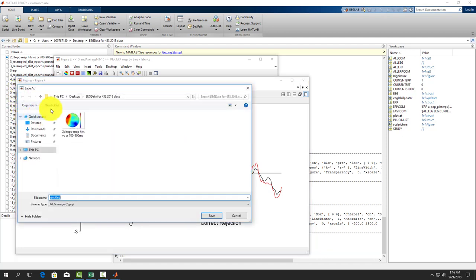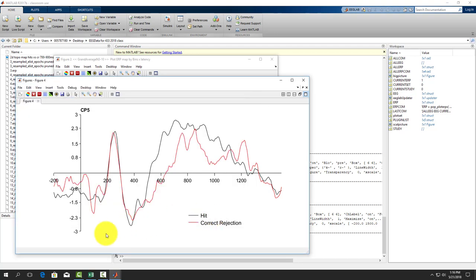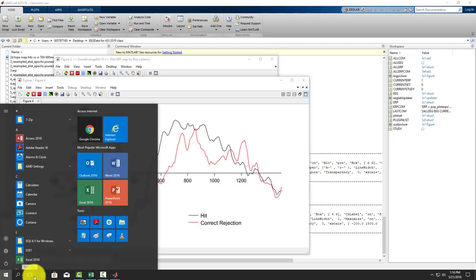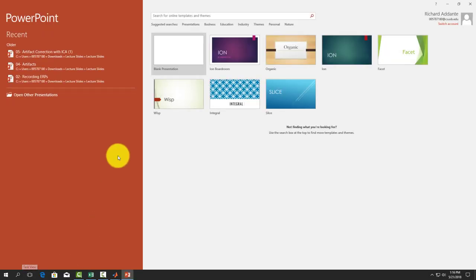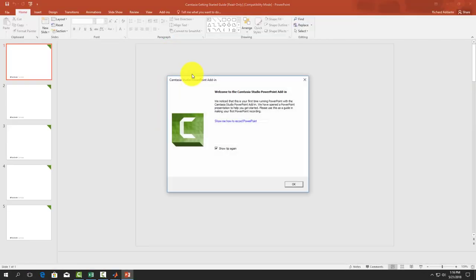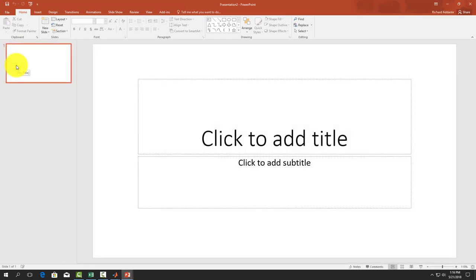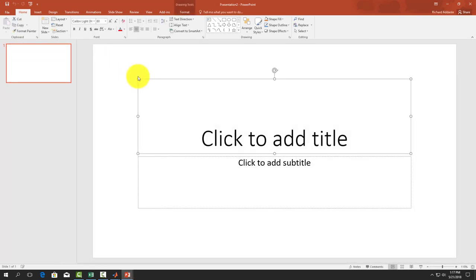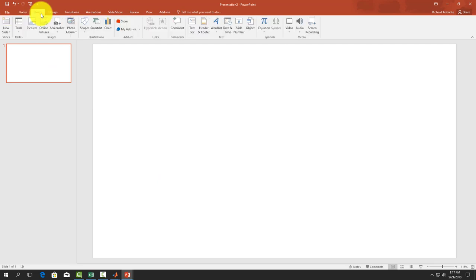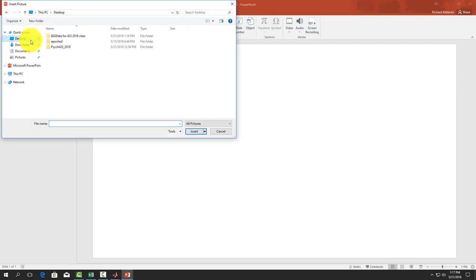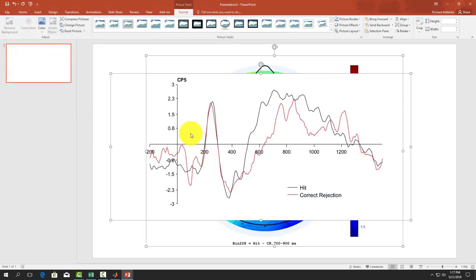Let's save this. We name it the ERP, hits and correct rejections at electrode CP5, and save it as a JPEG. Now let's open up PowerPoint, grab a blank presentation. We can delete all of our stuff in there. Let's go to insert pictures, navigate to where we saved our data, and let's insert those two figures.